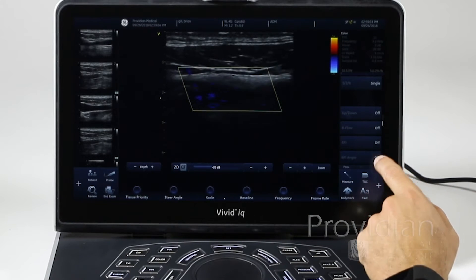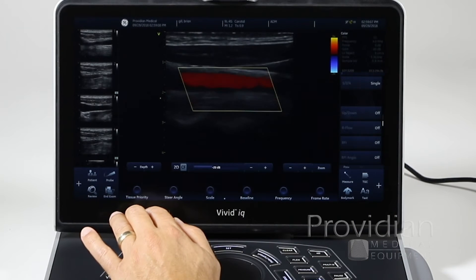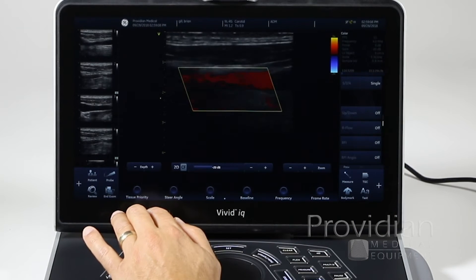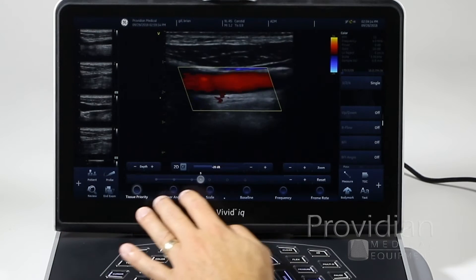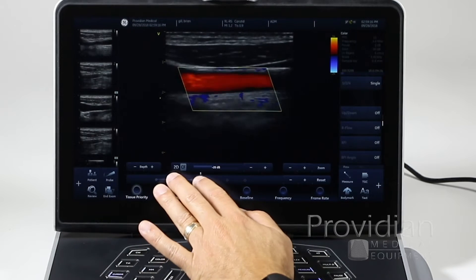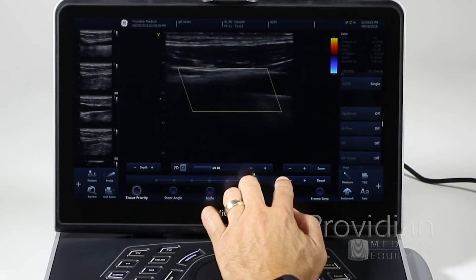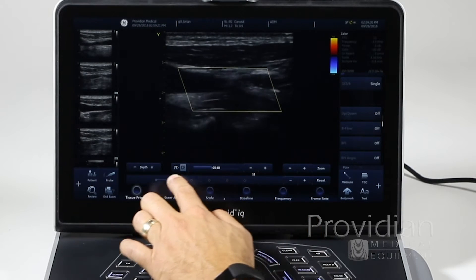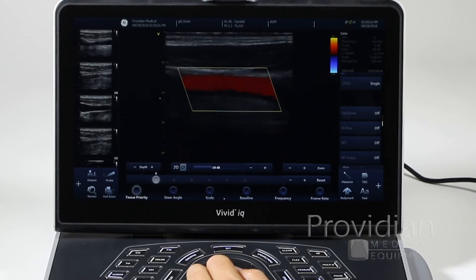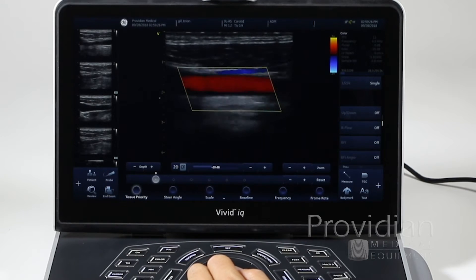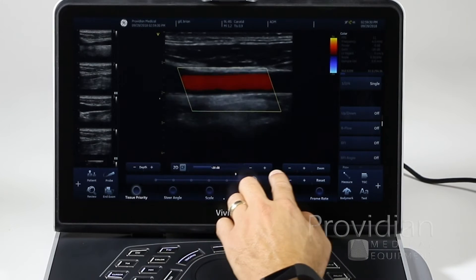Blood flow imaging and blood flow angio are right here as well. And going across the bottom, we have our tissue priority. What this is going to do is say, do you want more of the 2D image to appear or more of the color image to appear?